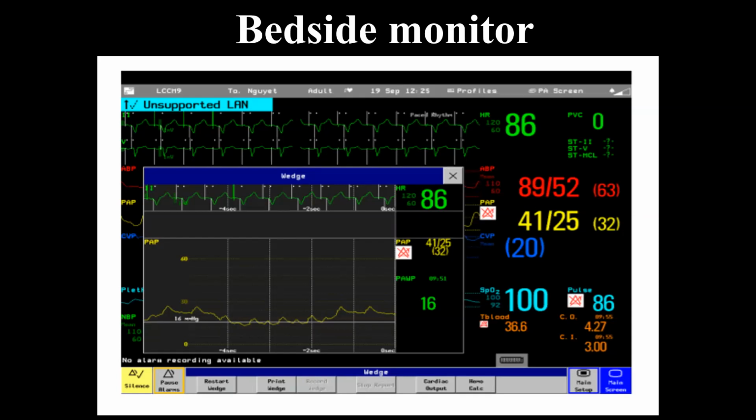So it's definitely an issue that we can't give volume. To get this blood pressure up, we're probably going to have to give a vasoconstrictor because they're already volume overloaded according to this side. Now we don't have that. Oh yeah, we do right here. What's our wedge? High, low, or normal?